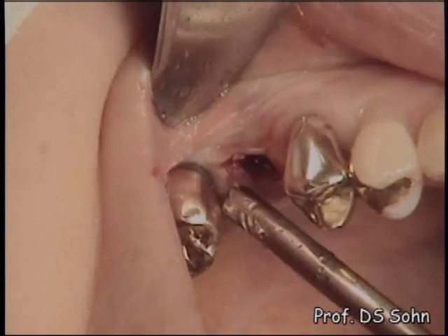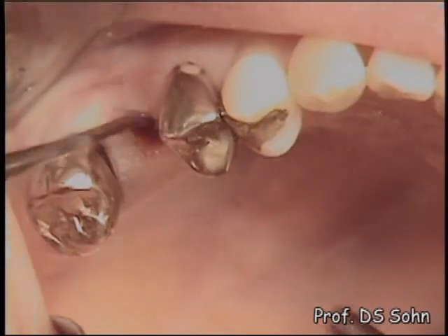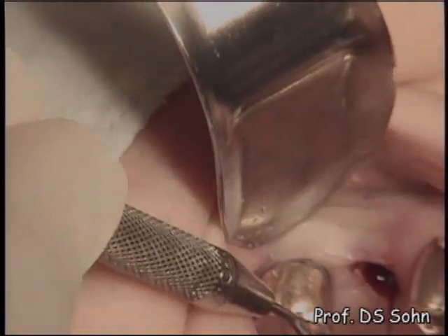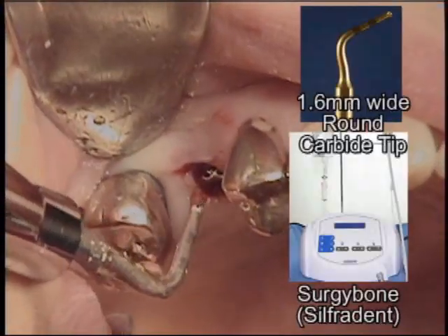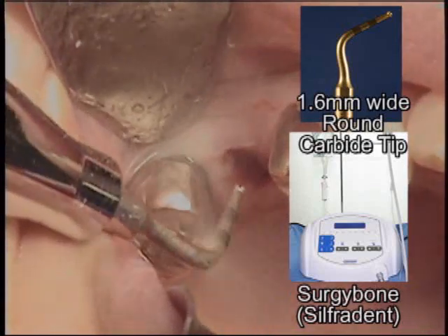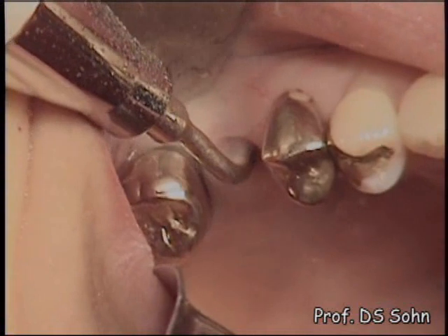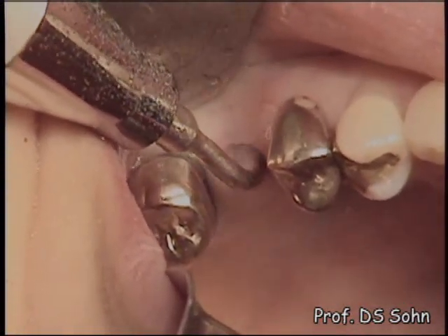A periodontal probe was utilized to measure gingival depth at mesial, distal, buccal, and palatal areas. A round carbide tip attached with an ultrasonic device, SurgBone, was utilized to break the sinus floor directly.